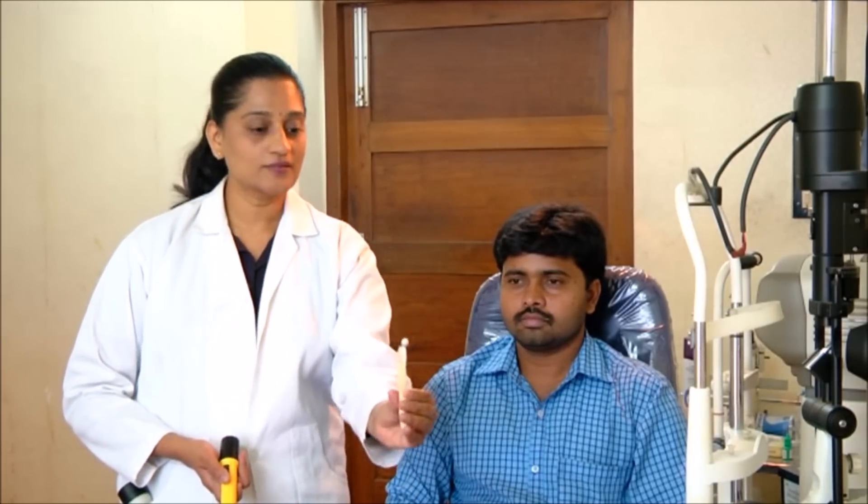Finish your pupillary examination by giving an accommodation target to rule out light-near dissociation. If there is a light-near dissociation, be rest assured there is some brain pathology and you will have to discuss your case accordingly. Ask the patient to look straight, then introduce the target from below so the patient looks from far to near, and observe the pupillary reaction. Being a right-hander, hold the torch in the right hand and give the accommodation target in the left. There is no light-near dissociation, ruling out any potential midbrain pathology.